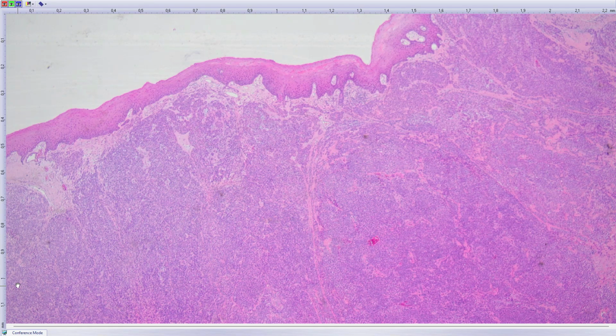This is a consult case from Italy, and the boy had a probatory excision from the tumor, which is located in the palate. It was diagnosed somewhere else, in another hospital, as adenoid cystic carcinoma, and then sent to us as a consult case.